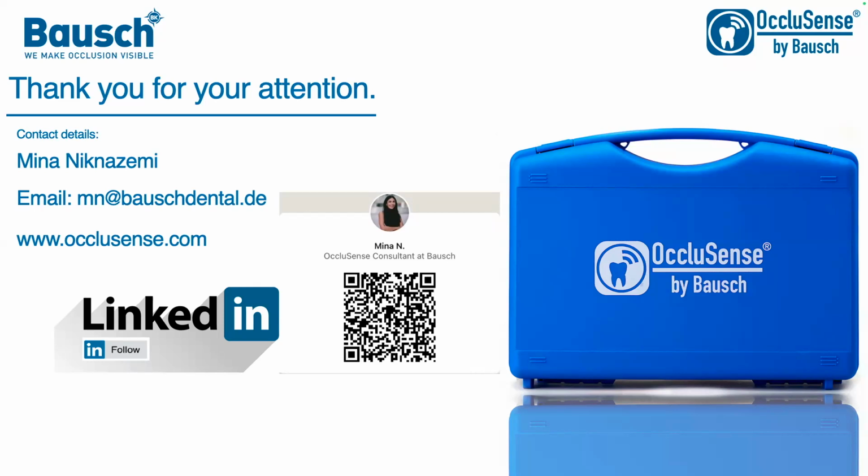Yeah, because why I was asking this, the T-scan sensor holder is a plastic holder, and I do find sometimes with patients it comes into movement interference. So that's exactly what I wanted to know. And as you said, there are two sizes. One is the regular size, and the other one is XL, which is basically to do with the width of the sensor, right? Yeah. So it's only the mouth opening. Okay.